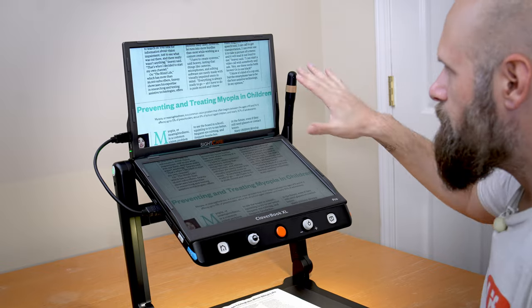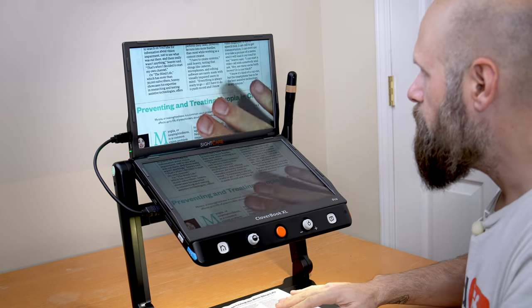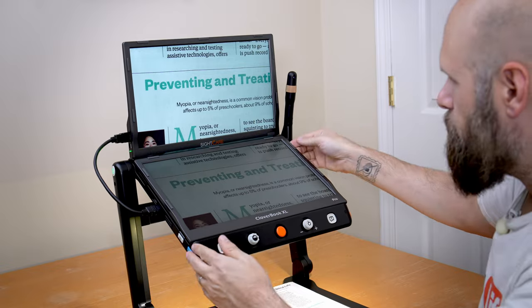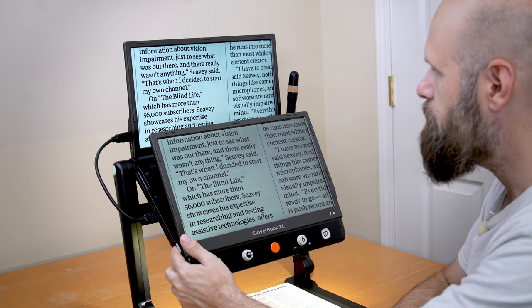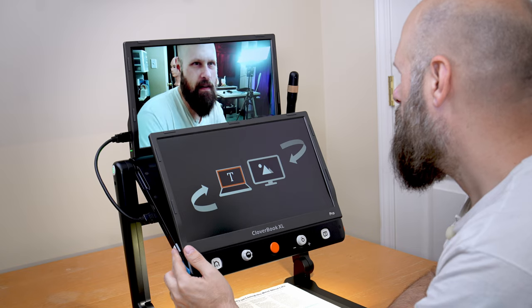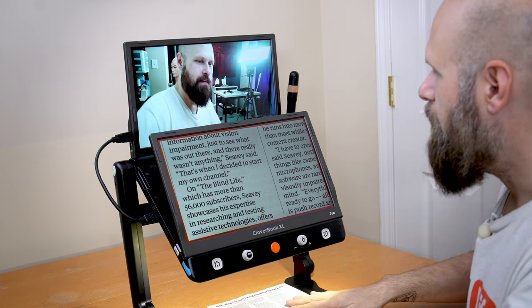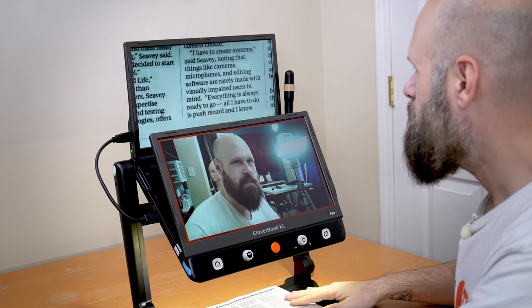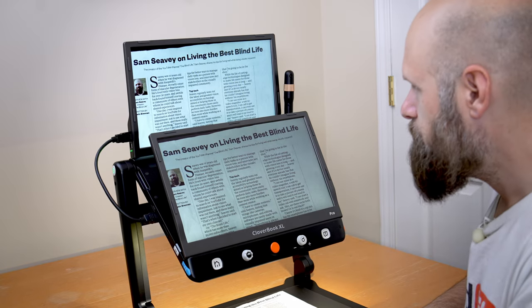I've plugged in the external screen. Right away you see the image is being mirrored on both screens, so if I zoom in the same image appears on both. To change the images, press that same button on the left side — distance view, then split screen. Now we have split screen with the distance viewing camera on the upper screen and the document camera on the bottom. This is technically called screen copy because the image is being copied on both screens.